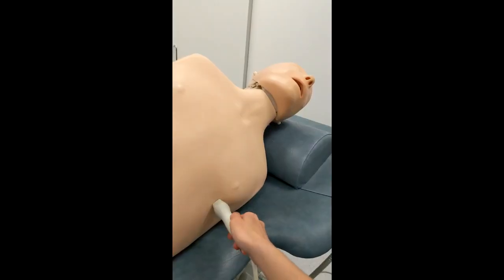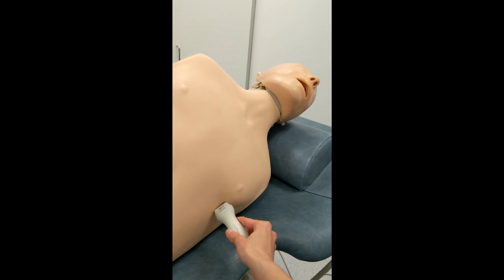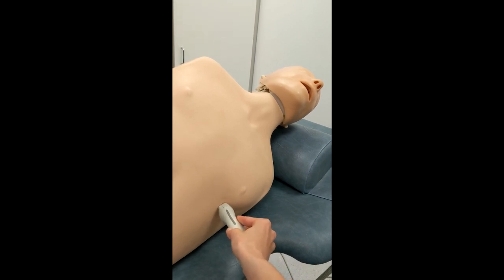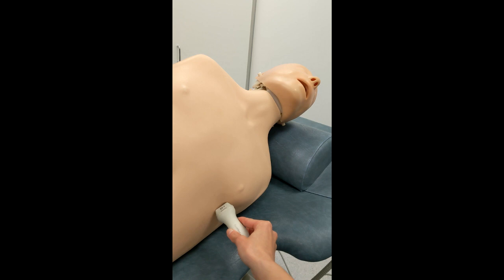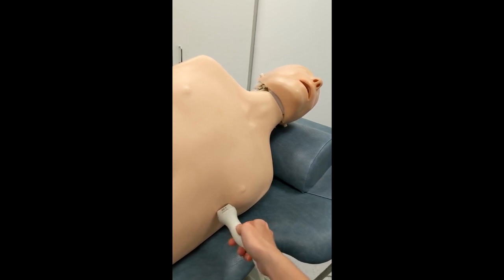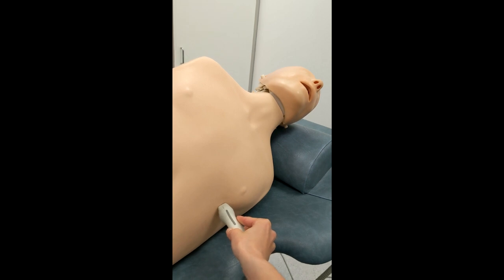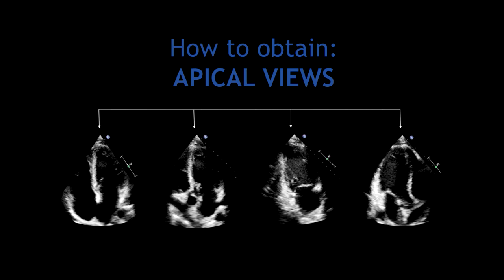In this video, I'm demonstrating how to obtain the different apical views. Just rotate the probe counterclockwise to obtain the different cuts. I'm starting here from the four-chamber view, rotating now to obtain the two-chamber view, and finally keep rotating to obtain the three-chamber view. And that's how you obtain the apical views. Normally, we always start by finding the apical four-chamber view, and from that point we rotate the probe counterclockwise to obtain the rest of the views.